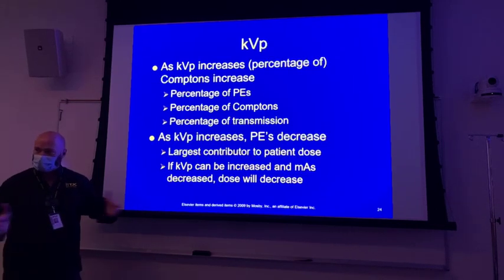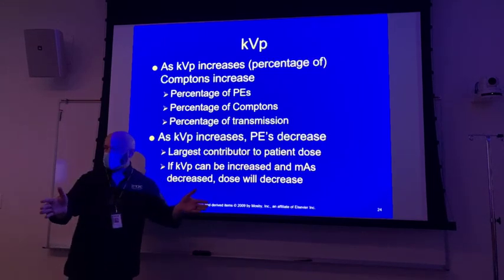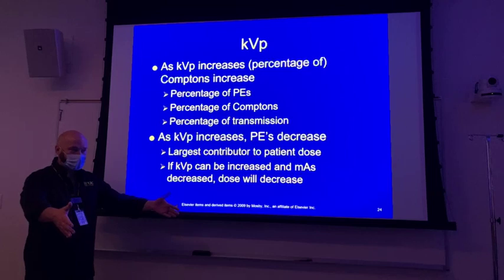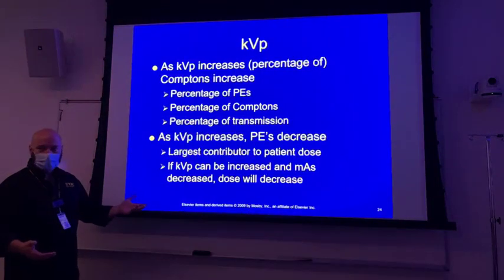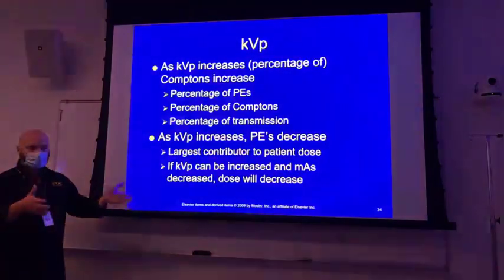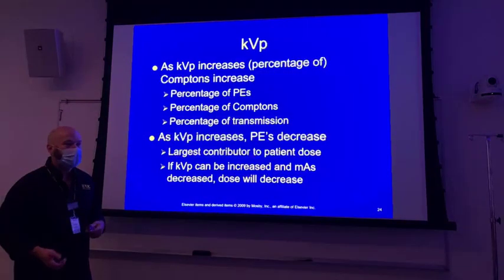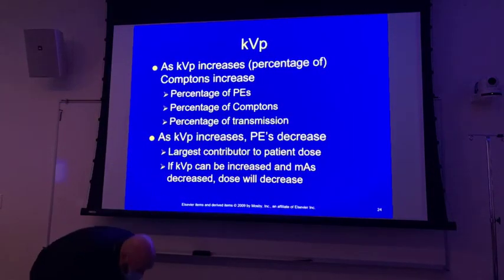keeping in mind that x-rays don't bend like light does. It travels in a straight line, right? Until it hits something, then it redirects. So you stand behind that portable, right? And you're watching your patient, and you know the patient can cooperate. If you got an uncooperative patient, you might not be able to do this, but if the patient can cooperate, you say, okay, I want you to take in a big deep breath, blow it all the way out, take in another deep breath, oops, beep.